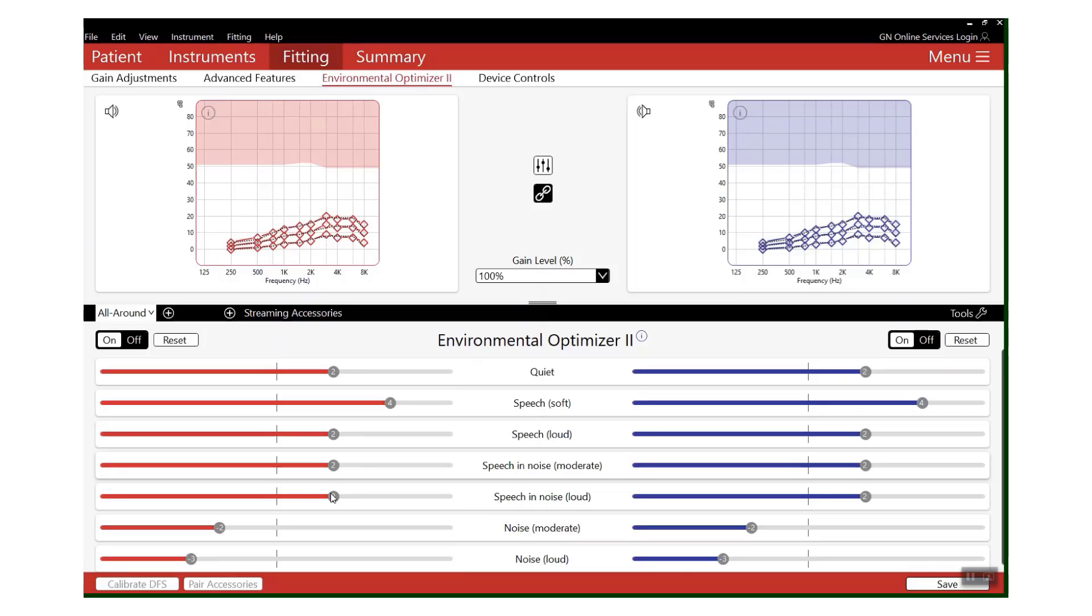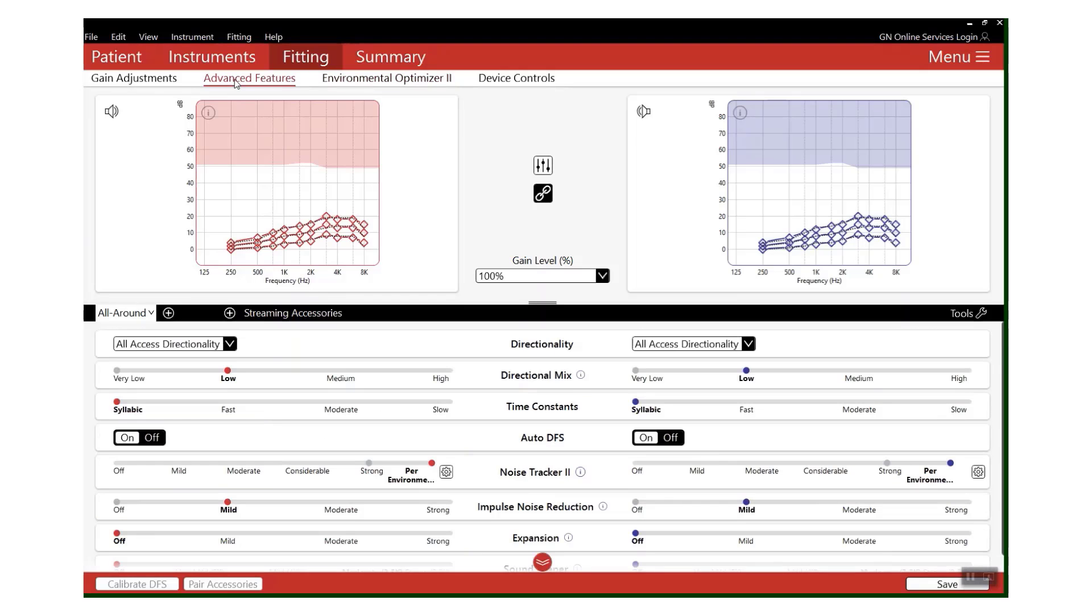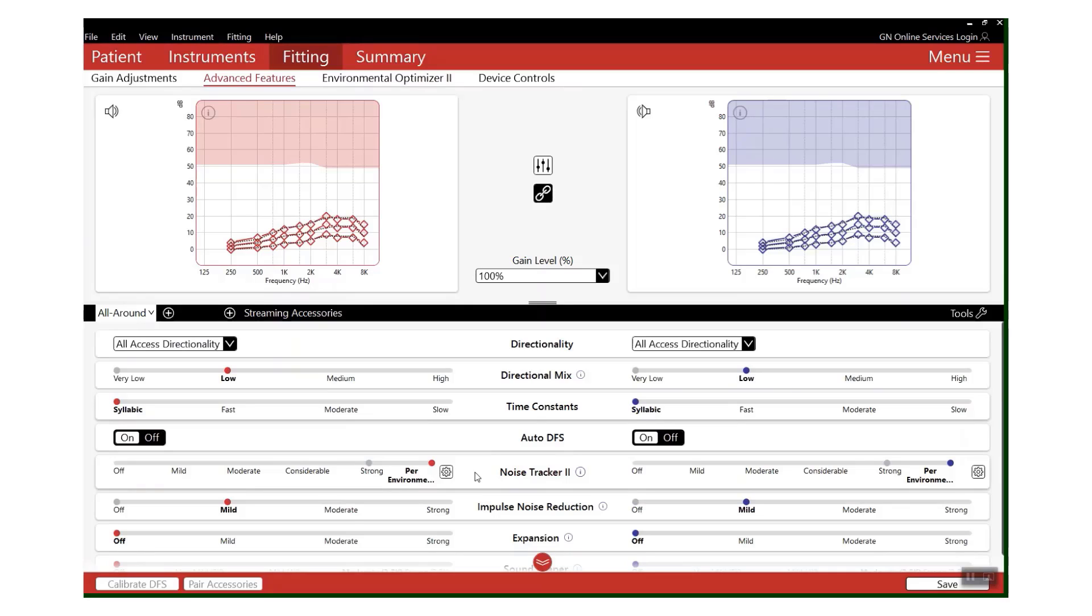However, here comes the good stuff. Our second step is going to be found in Advanced Features. You'll find something called Noise Tracker 2.